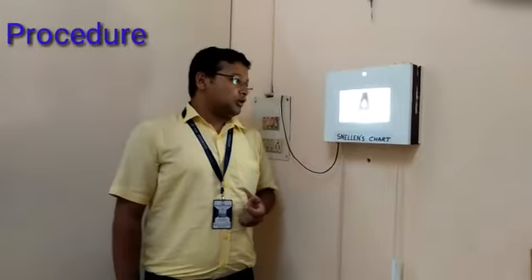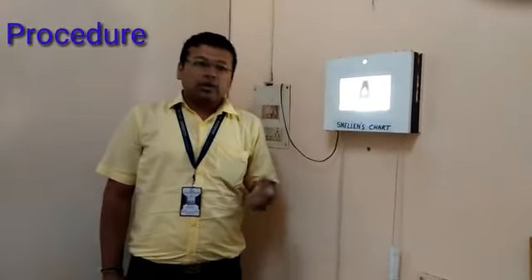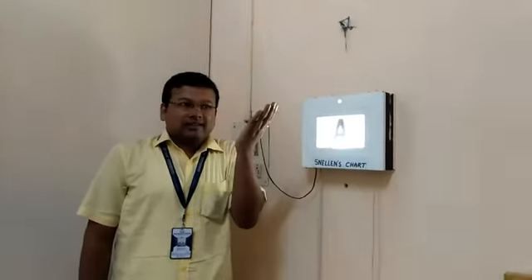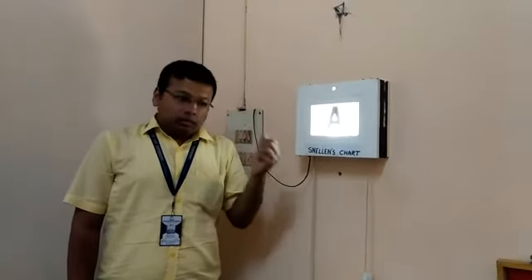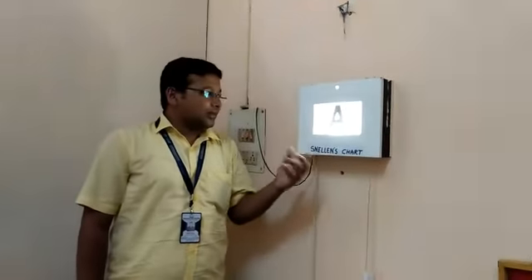For measurement of visual acuity, first ask the patient to cover one eye with an occluder, or you can use a tissue paper also to occlude the eye. And the patient should not press the eye, because if the patient presses his or her eye during testing, it may distort vision when we test the unoccluded eye next time.